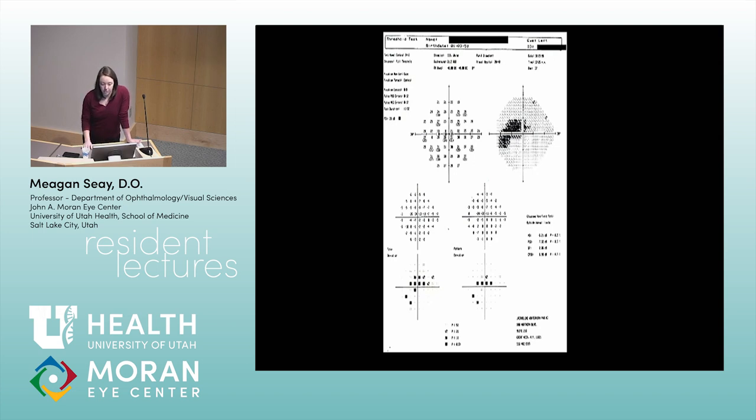Brad and Chris, give us some thoughts on this. So we said it could be a partial arcuate defect or a cecocentral defect. We would want to know the age of the patient for sure, and obviously any ocular history. Do they have a known diagnosis of glaucoma or IIH? I think those would be very important. The other eye might be helpful. Hopefully, visual field is done. Yeah, both probably. So let's say this is a 30-year-old, and let's say the right eye is normal.